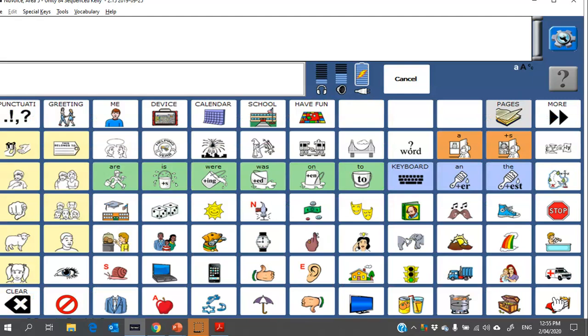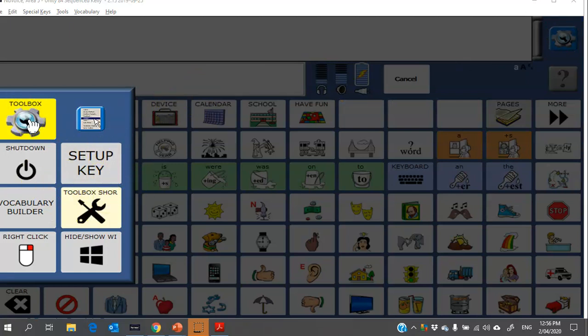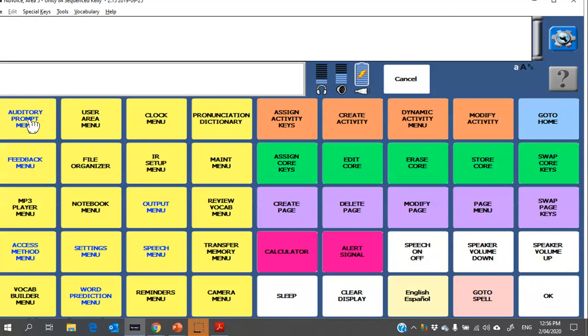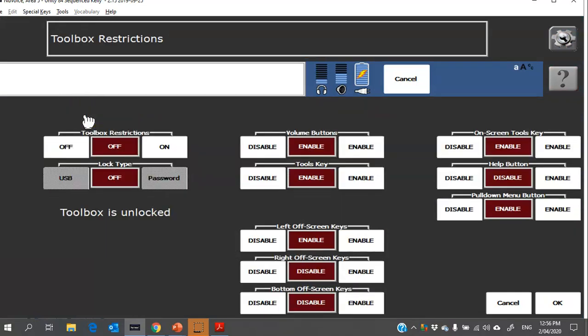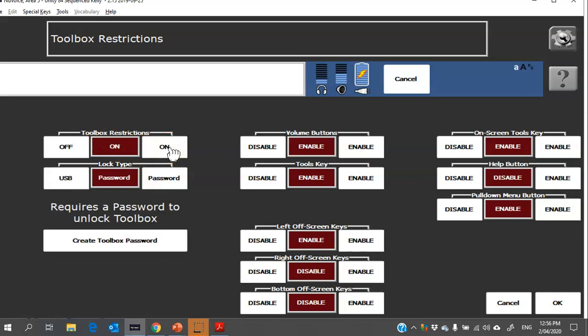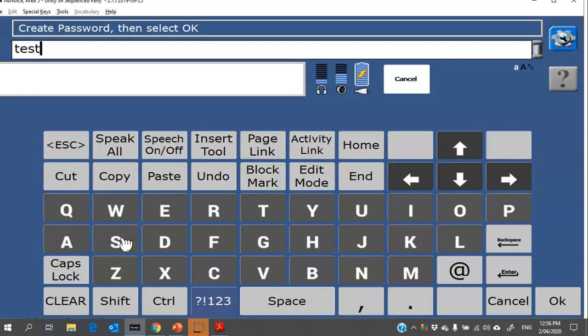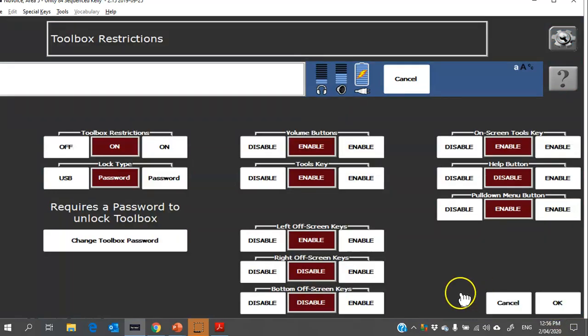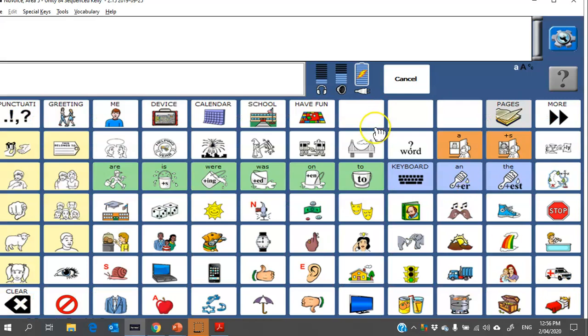All right, almost there. The next thing I wanted to show you is how to lock the toolbox. Now this can be important if you're concerned that the user might get into the settings or they might be distracting for them. So to do that, there's two ways. I'll show you the most common way today. So you go into your toolbox and then into your maintenance menu here, and we're going to choose toolbox restrictions. You're going to turn those on, and then from here you can choose, I think the most common type is to set a password. Okay, so I'm going to make sure it says password. Then I'm going to create a password. In this case, we'll just call it test and click OK. OK, OK and OK.